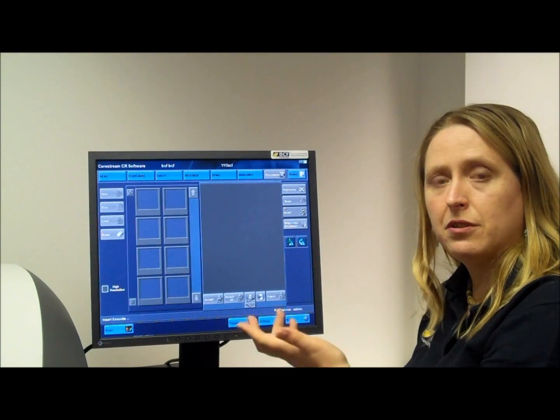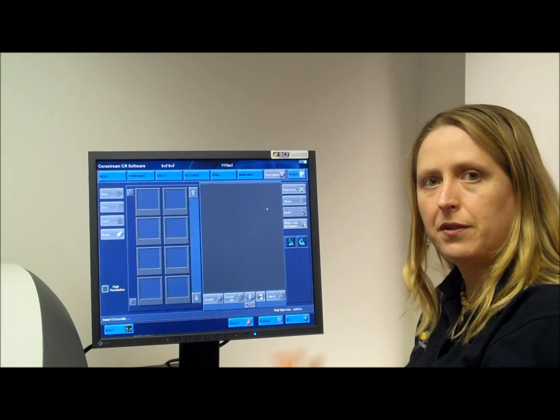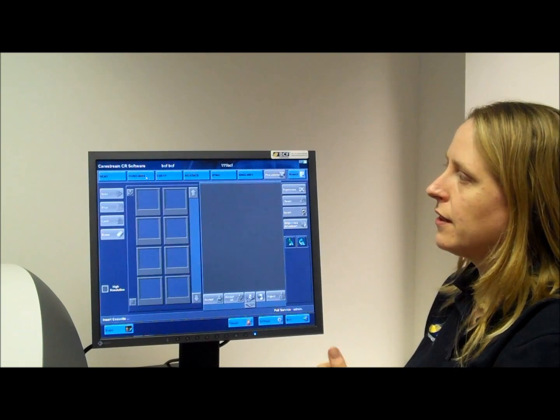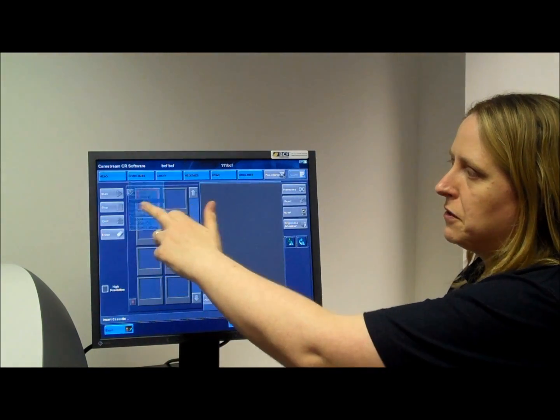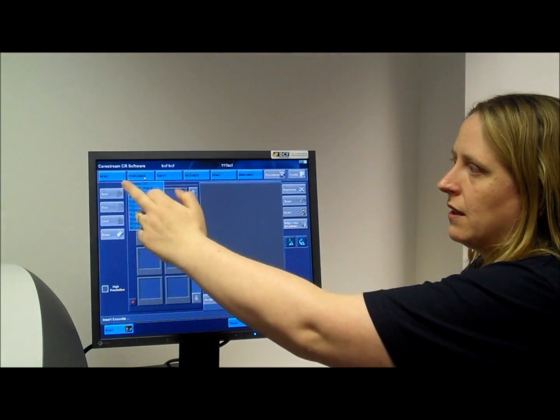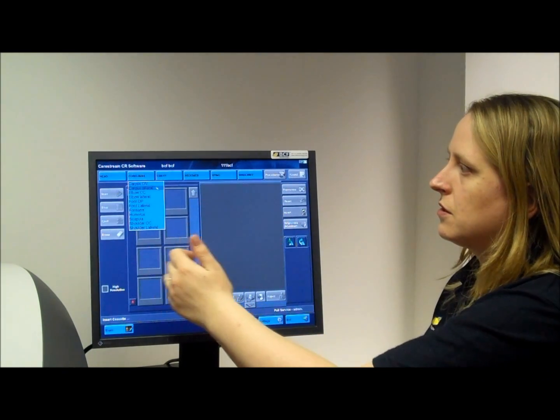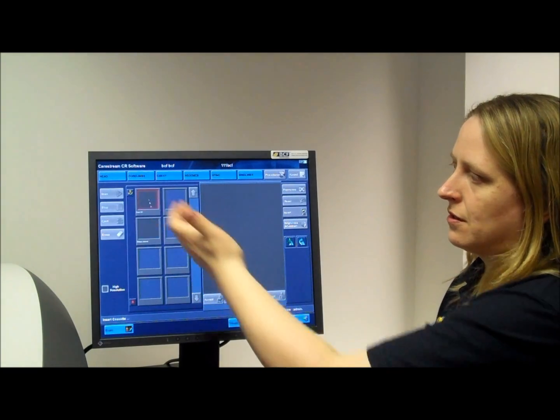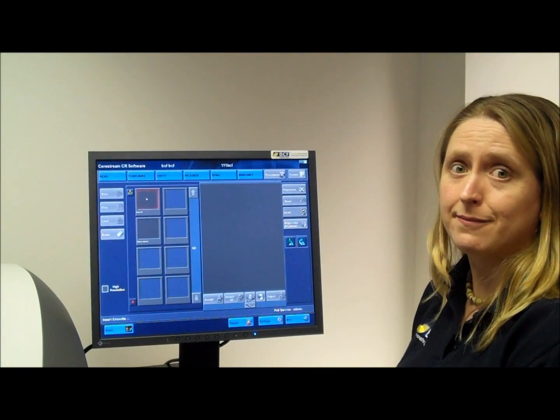Now you're in your image acquisition page, you can choose the body part that you're about to process. So we'll use a forelimb and foot DP. All of the things within here we can actually customise if you want us to, and you can add additional shots as well. And now we'll process our plate.